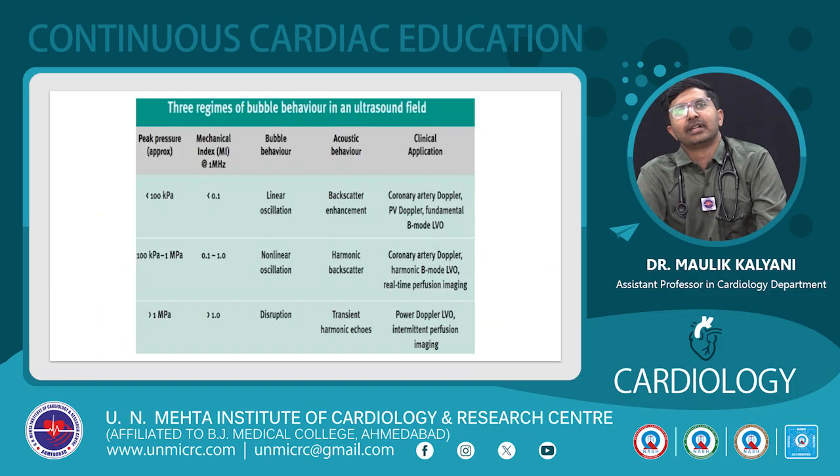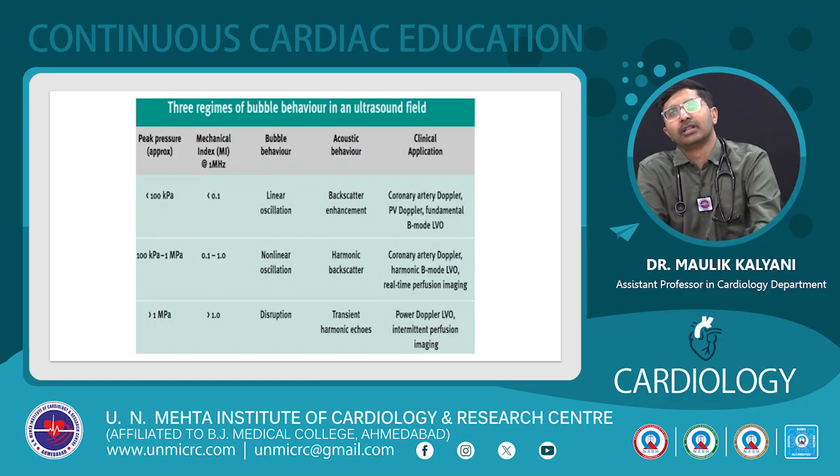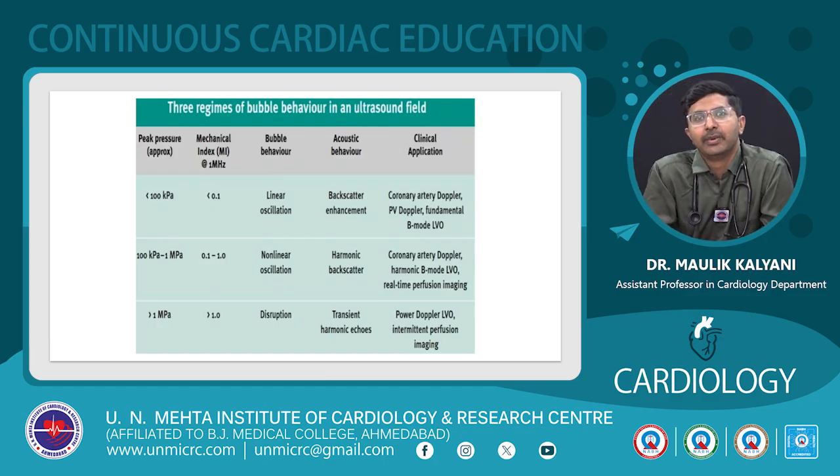And so these are the mechanical index and their behavior in ultrasound bubble behavior. So at 0.1 mechanical index, there will only be linear oscillation. From 0.1 to 1, there will be non-linear and high harmonic oscillation, and from more than 1, there will be degradation.